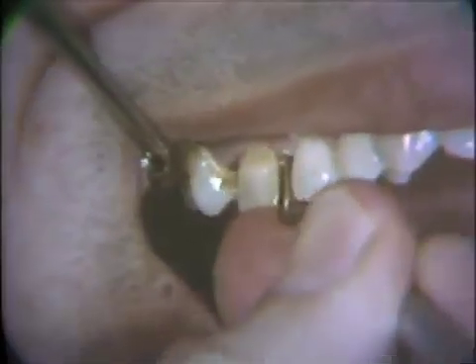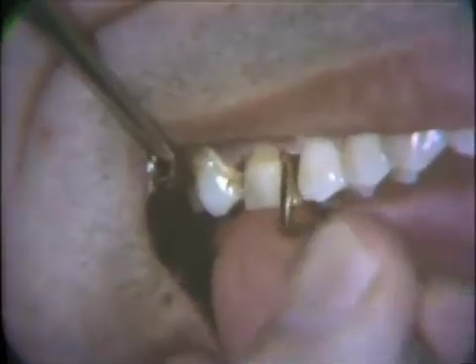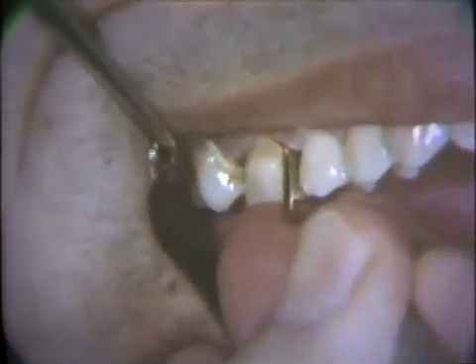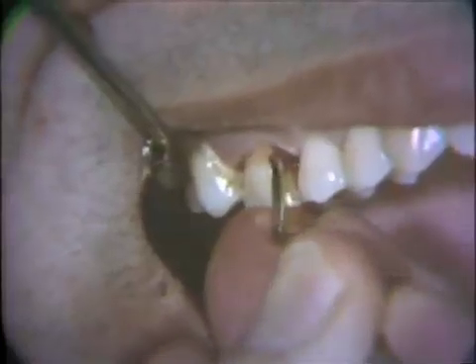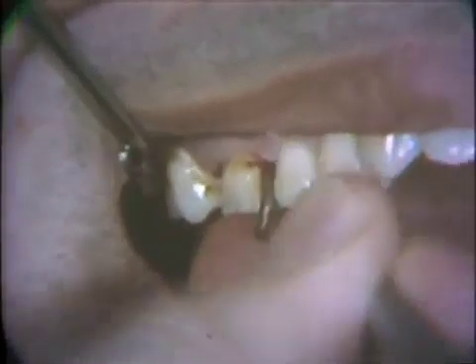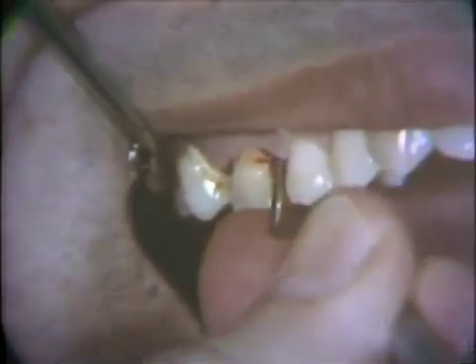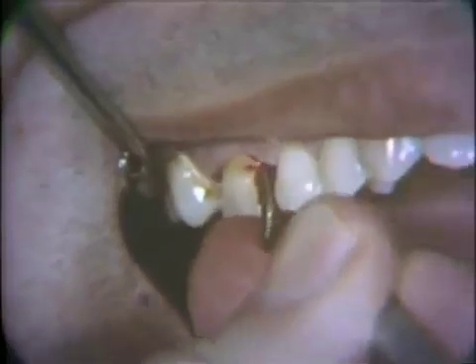In deep or intra-bony periodontal pockets where deposits are tenacious and access is poor, a hoe should be used to remove the subgingival calculus.